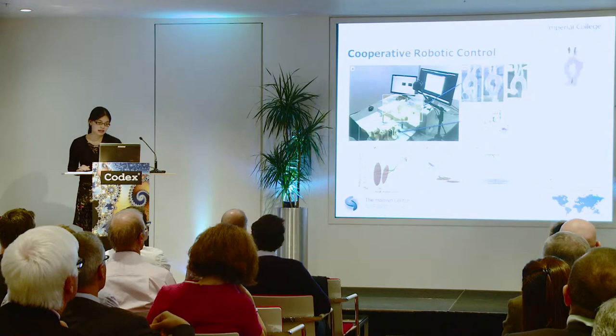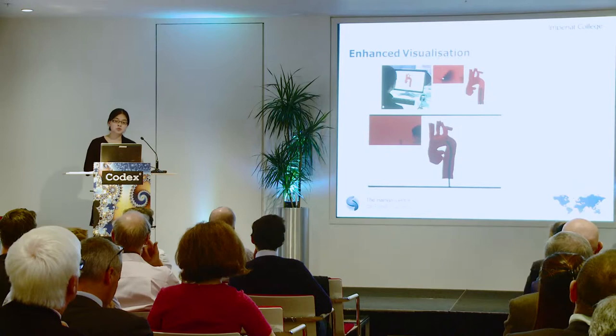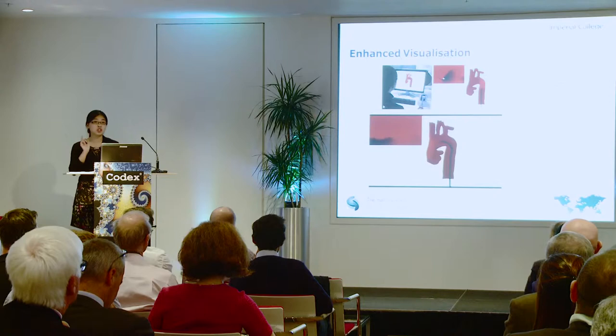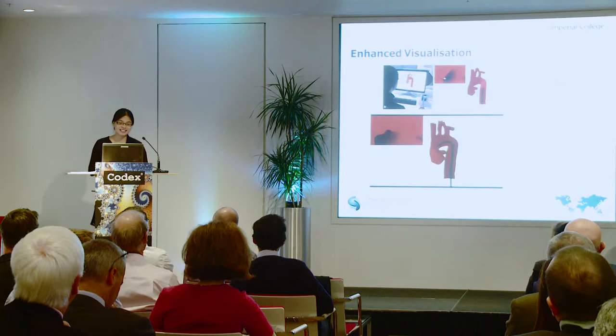We're also looking at enhanced visualization. This is my former work, in which I'm trying to remove X-ray images out of the equation. In this case, we're looking at simulating endovascular intervention using what I call a virtual endoscopic view, where you're mimicking a camera at the end of the catheter and driving through it. Like our clinician says, it's kind of like you're driving your car through Grand Theft Auto. That's fine. Fair enough.